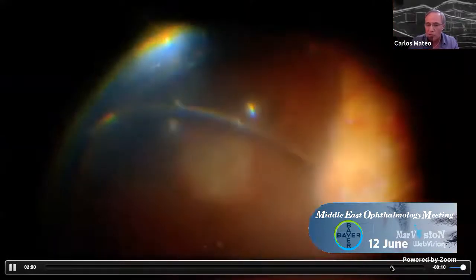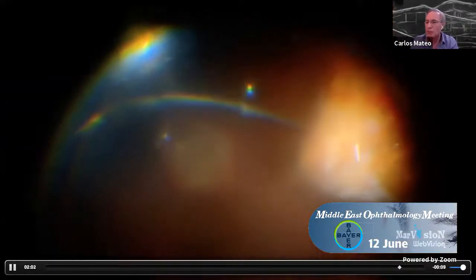It's not that easy to know where the fovea is going to be, but the most important thing is don't elevate the tissue, because if you elevate the tissue, it rolls, and this is terrible. Then you put it there, and the trick is to begin to inject perfluorocarbon liquid in the vitreous cavity and to remove the perfluorocarbon liquid in the subretinal space. This is somewhat tricky, but at the end, we are going to stretch the retina to the temporal side, injecting more and more perfluorocarbon liquid. We are going to put the retina in its place with the laser, as you will see now.